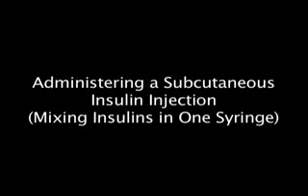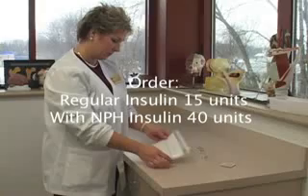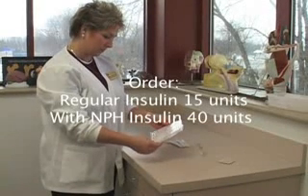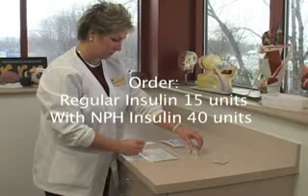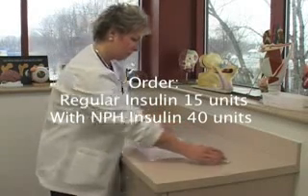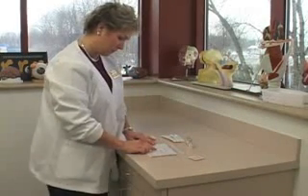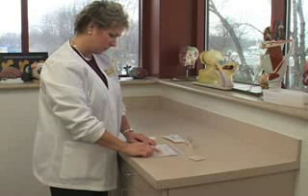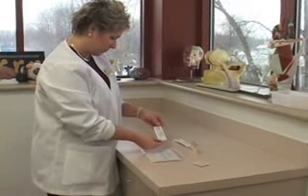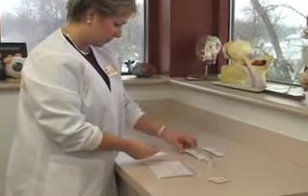Administering a subcutaneous insulin injection, mixing insulins in one syringe. Check physician's order and assemble equipment. Calculate the total number of units of insulins to be drawn into syringe by adding the number of units of regular insulin ordered with the number of units of NPH units ordered. Choose the insulin syringe of appropriate size based on the total number of units to be given.